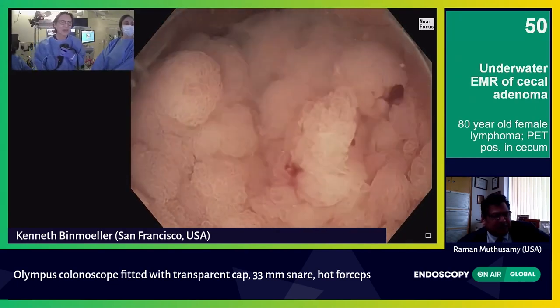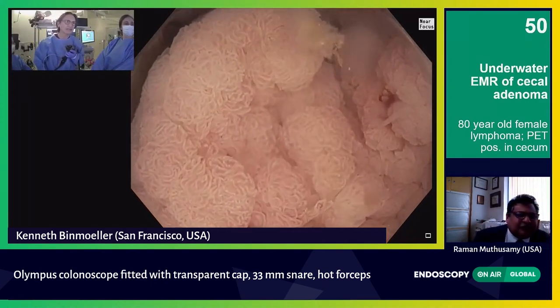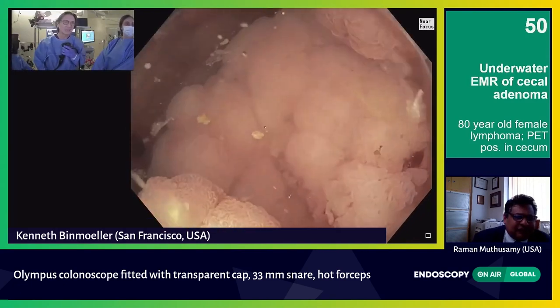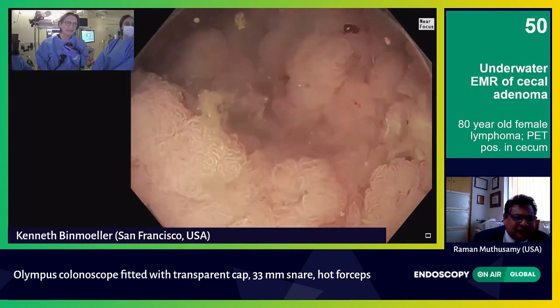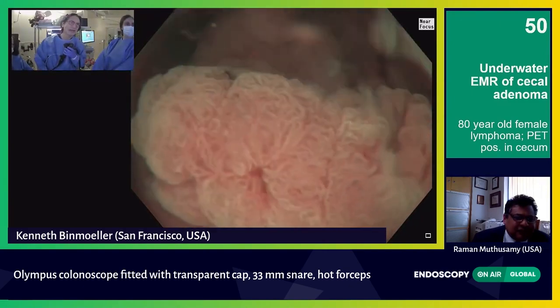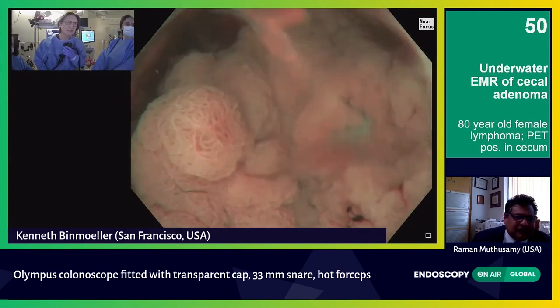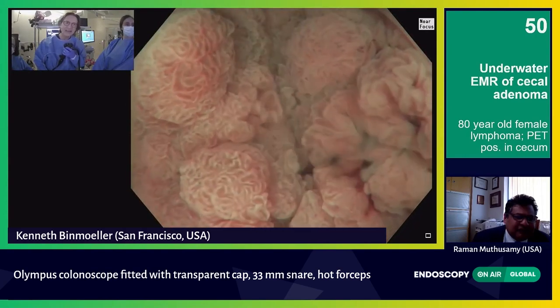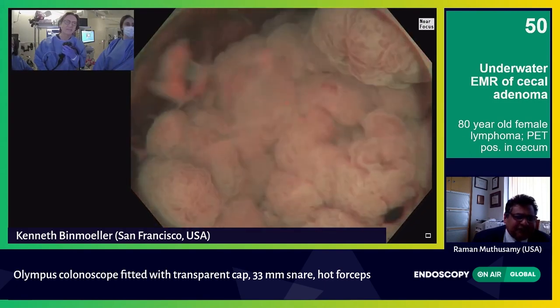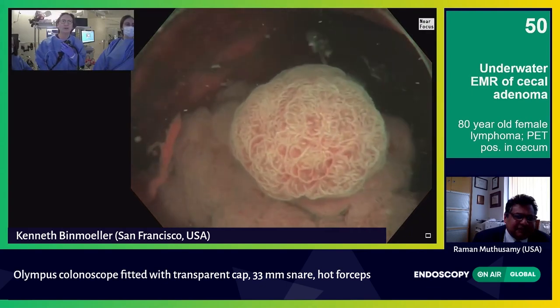Here now we can see very nicely how everything floats up. You can see the pit pattern even better — these are branched pits. We can also look at this with NBI. It looks very nice. I didn't really see any truly depressed areas. I think it's just that this is so villous that there are areas of relative depression and then more polypoid parts.